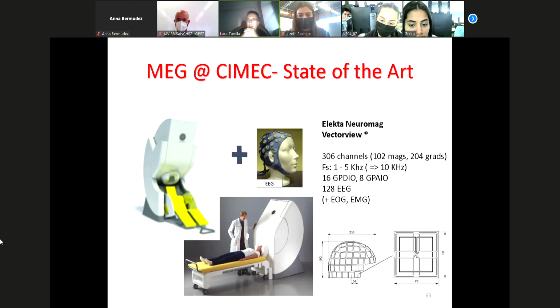There's a very new wave of studies, for example, that use the MEG in order to study speech perception. So how we understand while other people talk. And in this case, what they do is use continuous stimulation. So you will hear, for example, a story, and you can record the information coming from the auditory system into the MEG, and then compare how the brain changed with respect to this stimulation. So MEG and EEG are very powerful also when we want to understand how the brain might represent stimulation that is continuous and very complex. We will come to this later on.